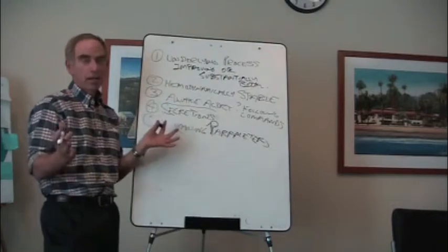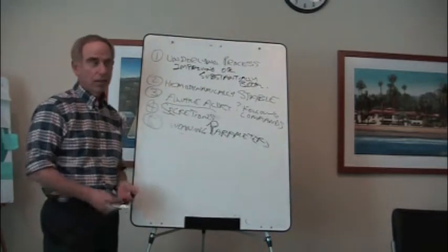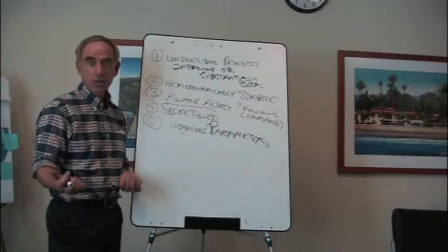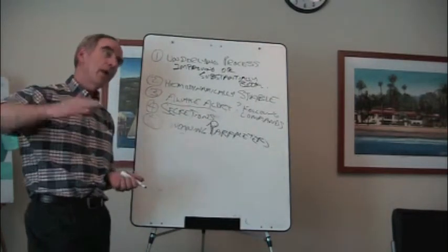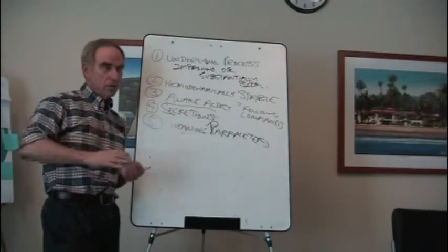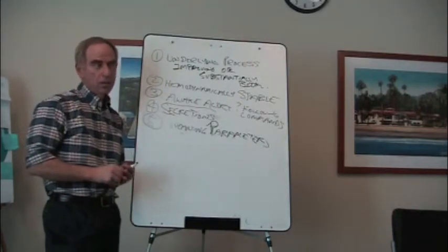Am I over-distending their alveoli? Are they in heart failure with very low cardiac output? What is causing this increased dead space in this patient? Do they have really weak diaphragms and their tidal volumes are very low, so they're having to breathe really fast? And so their dead space tidal volume fraction is increased, right? Because they're not able to fill their lung as much. They have relatively more dead space with each breath.